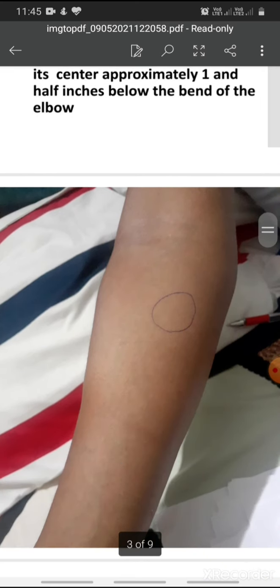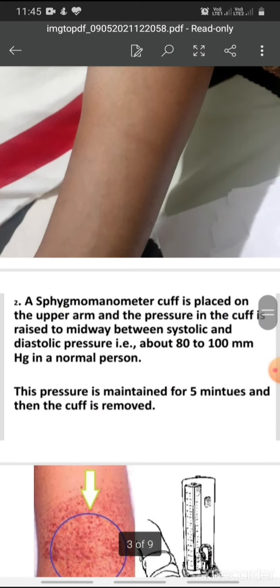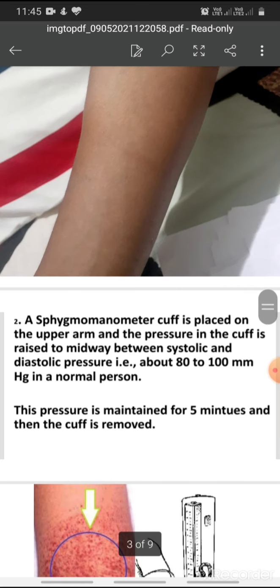You can see a sphygmomanometer cuff is placed on the upper arm and the pressure in the cuff is raised to midway between systolic and diastolic pressure, that is about 80 to 100 mm of mercury in a normal person.